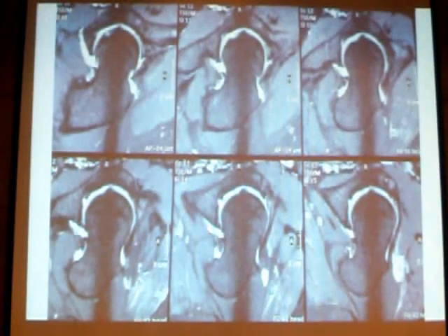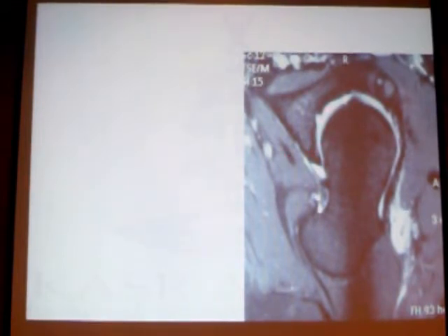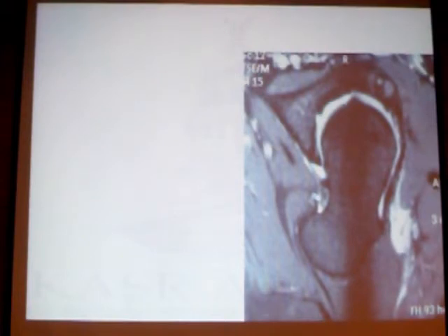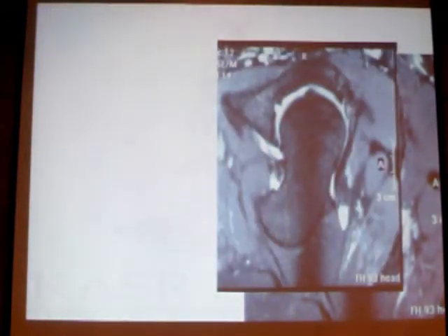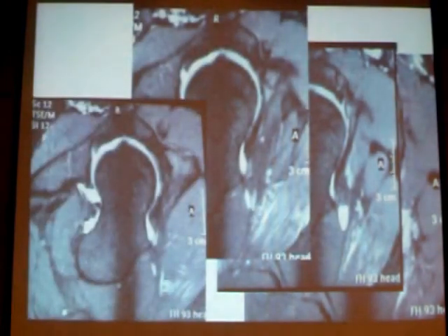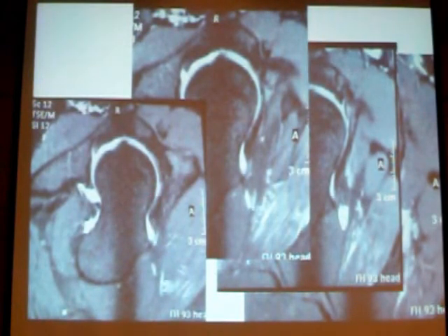This is a normal sequence of MR arthrography. We can see the labrum — the black structure here and here — and then we can detect the condition of the cartilage. The same thing for this view, and this view, and this view. We can see the distortion of the wire here, which corresponds to the position of the bump. That is the corresponding position to the site of impingement between the head and neck junction and the acetabulum.